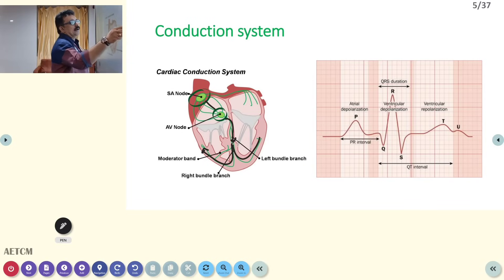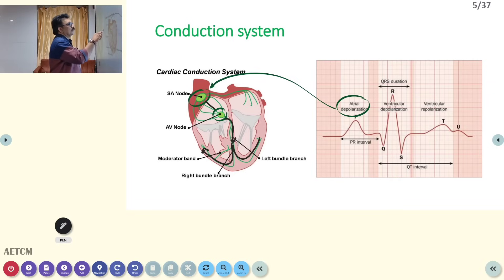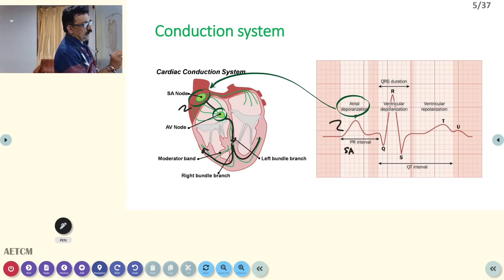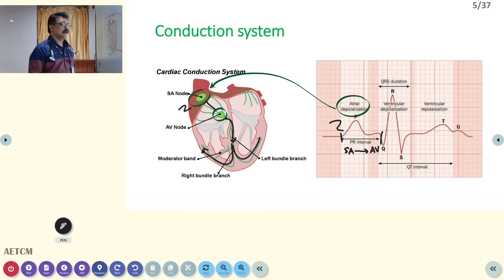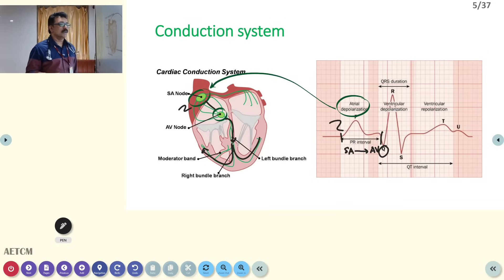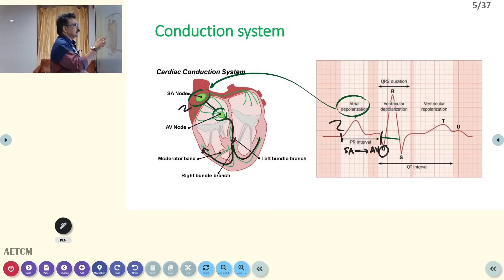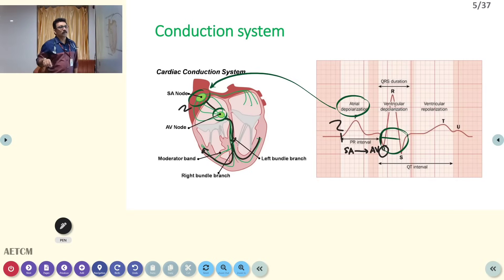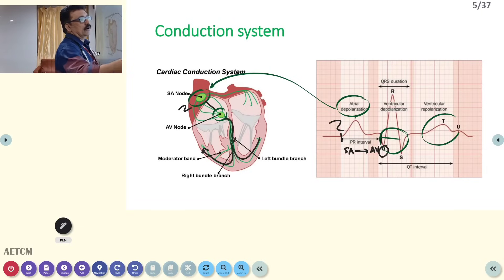The P wave is produced by atrial depolarization from the SA node. The PR interval goes from onset of P to onset of QRS. The first negative deflection is the Q wave, though Q waves may not be visible in most normal ECGs — they are properly seen in myocardial infarction. The QRS complex is produced by ventricular depolarization. T waves and the ST segment are produced by ventricular repolarization.